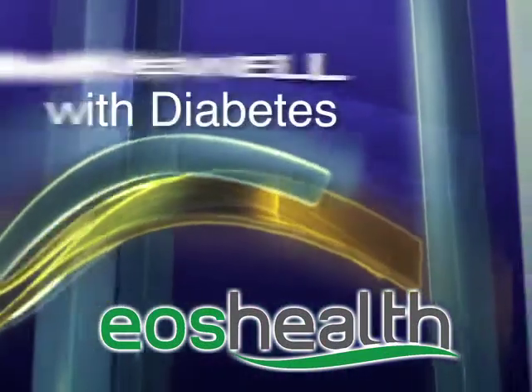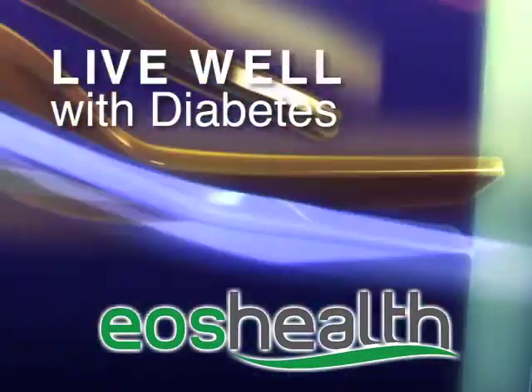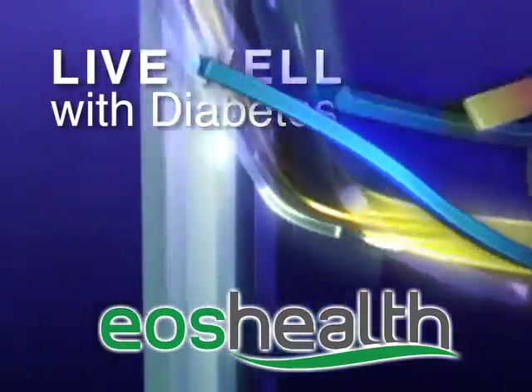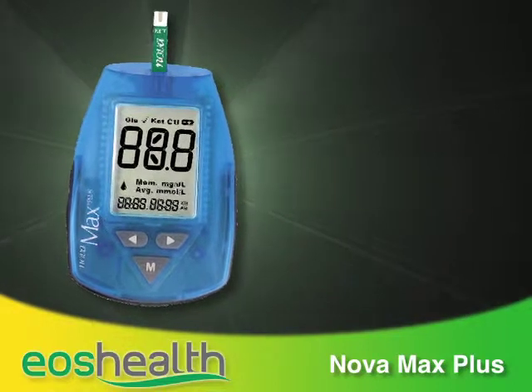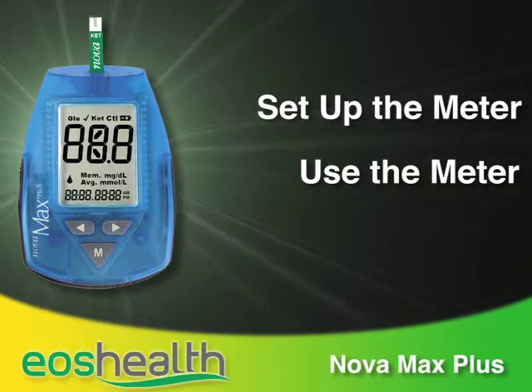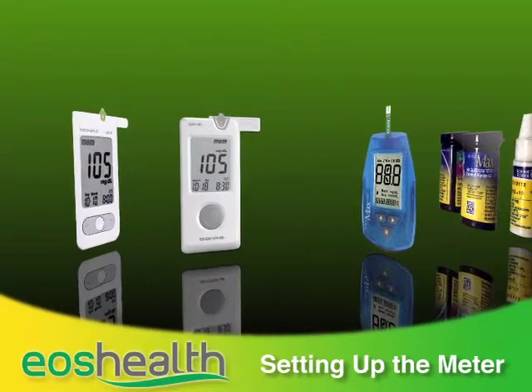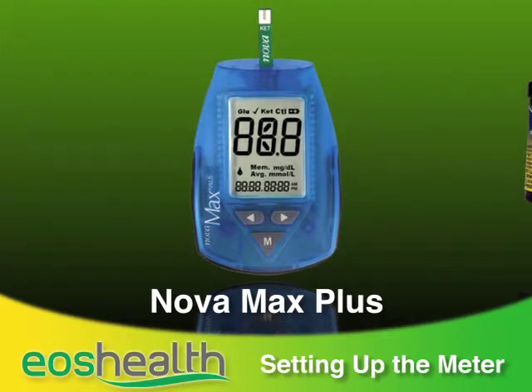Eos Health — helping you live well with diabetes. An important part of managing your diabetes is monitoring your blood glucose and ketones on a regular basis. Eos Health has provided a highly accurate meter that will allow you to do this with the same blood sample. In this series of videos, we'll show you how to set up and use the Nova Max Plus glucose and ketones meter and then send in the meter readings.